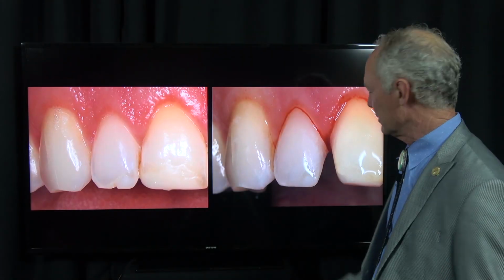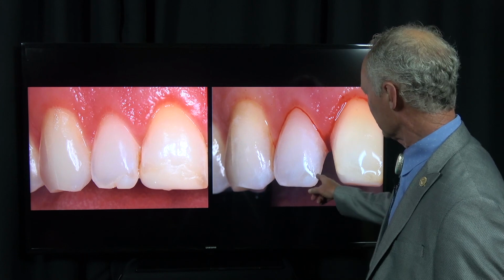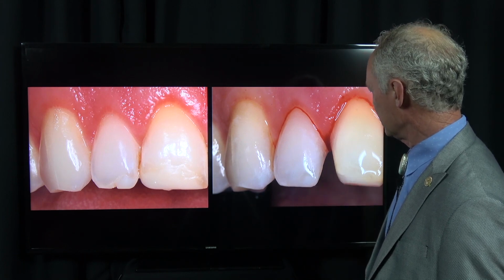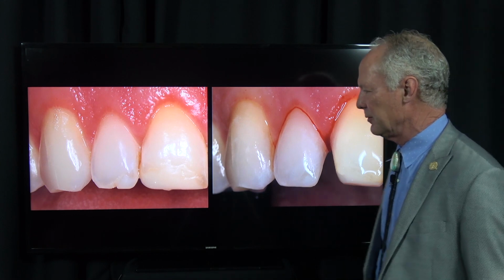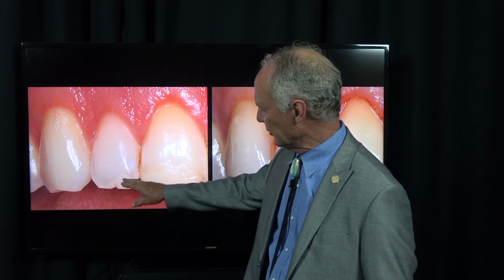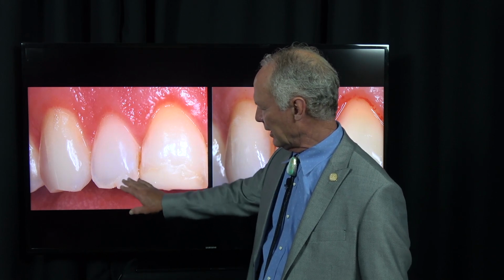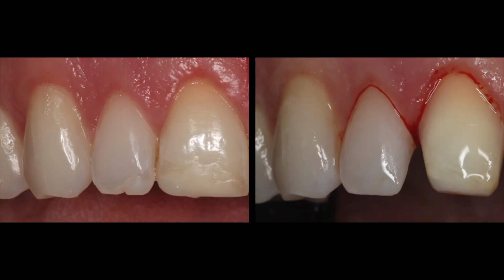Let's discuss composite bonding of a class 4 fracture of a maxillary lateral incisor. You can see I prepared the central incisors for porcelain veneers. You can see there was an old composite, class 4 composite on this lateral, and so I removed that composite, re-prepared the area, and then have rebonded and polished the restoration.